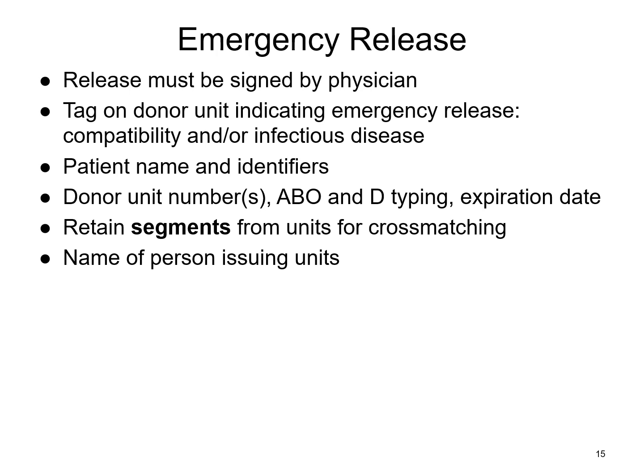You still have to identify the patient, so you've got to know who the patient is, with some sort of identifier on that patient. You have to have some kind of policy in place of how you're going to keep up with this information. So there's usually some kind of document that your facility will use to record all of this information, so that once you get a sample, then you can go back and backtrack on some of these things. But you at least need some kind of identification for that patient.